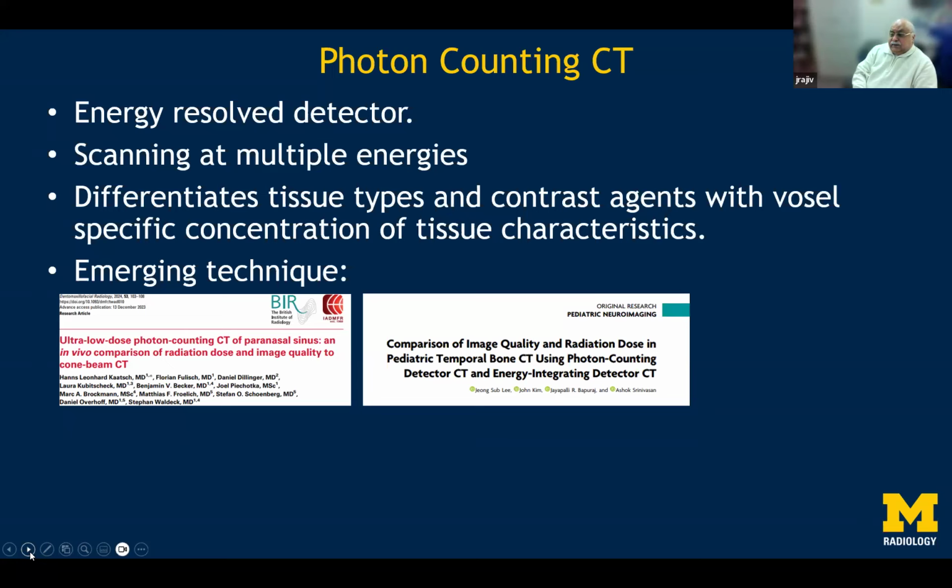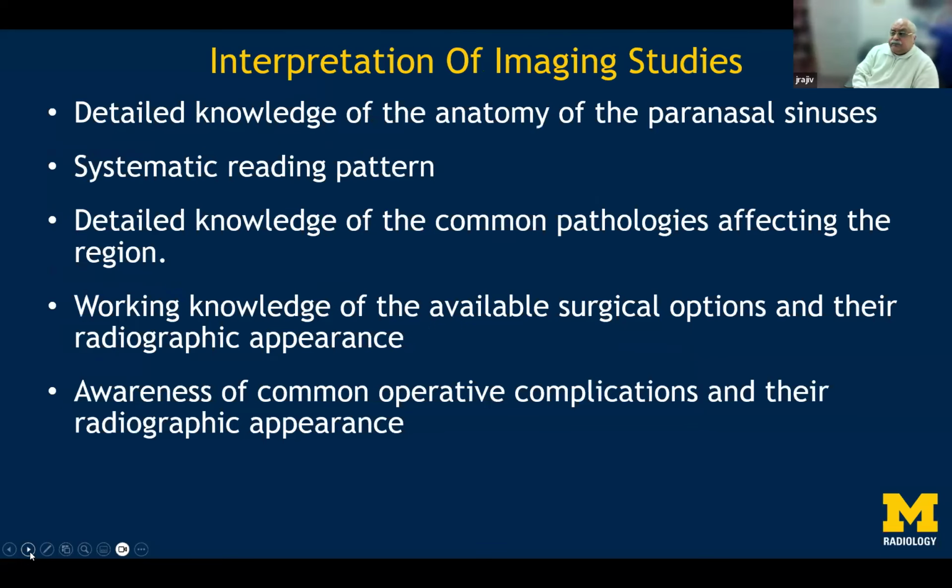So we also did a related study on imaging of pediatric temporal bone, and then compared with usual helical CT scans, and the comparison of image quality was considered to be at par with conventional CT studies.